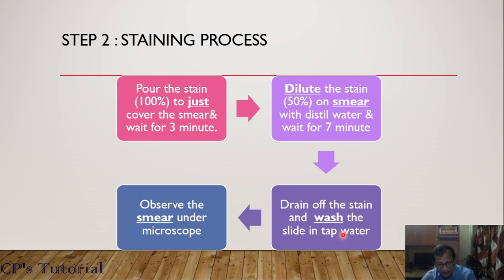Tap water, remember tap water, because tap water has different types of pH concentration. After washing the extra stain from over the smear with tap water, you should make it dry.